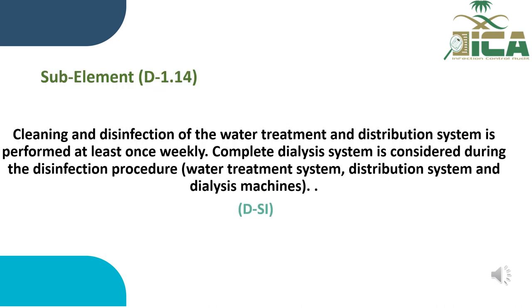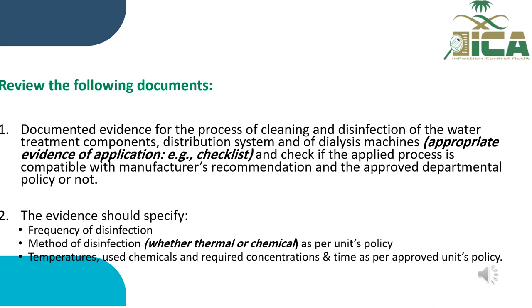Element D1.14. Cleaning and disinfection of the water treatment and distribution system is performed at least once weekly. The complete dialysis system is considered during the disinfection procedures. It is determined by documentation and staff interview. Review the following documents: documented evidence of the process of cleaning and disinfection of the water treatment components, distribution systems, and of dialysis machines.